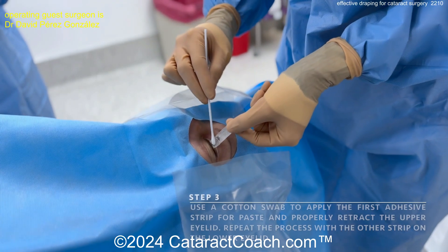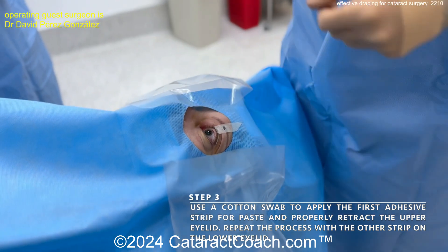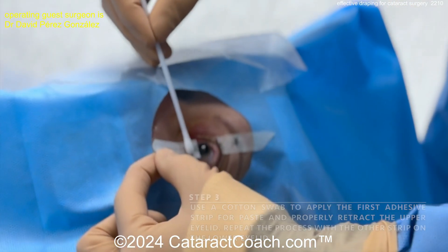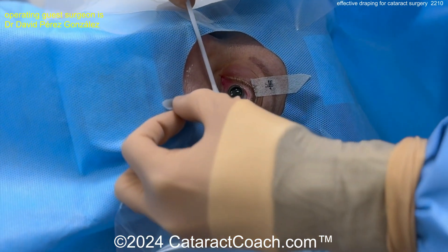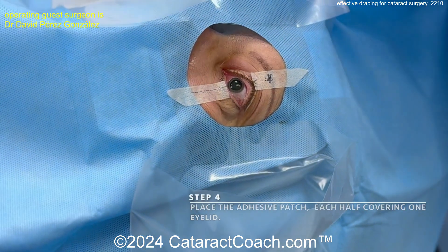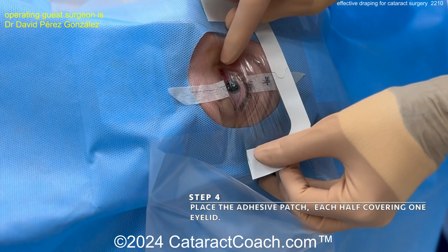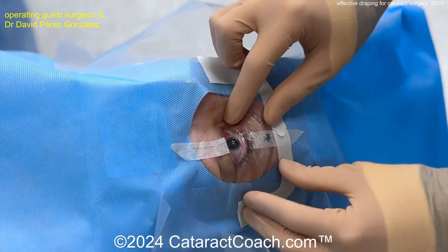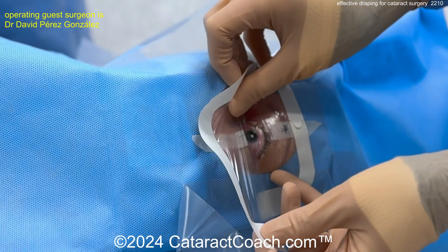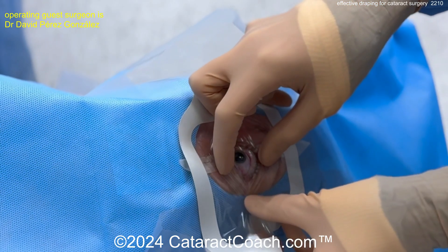Using the end of a Q-tip — again, no touching of the skin — and now opening the eye. The Tegaderm can be placed on that retracted eyelid. The Tegaderm is cut in half, and you do the same thing for the bottom eyelid. The Tegaderm is a flexible plastic sterile drape that covers the entire lid and goes over the lid margin. When you put the speculum in, it'll curl over underneath the lid margin, and you'll fully have sequestered the eyelashes and eyelid margin from your surgical field.